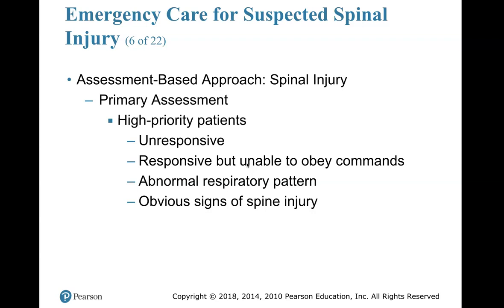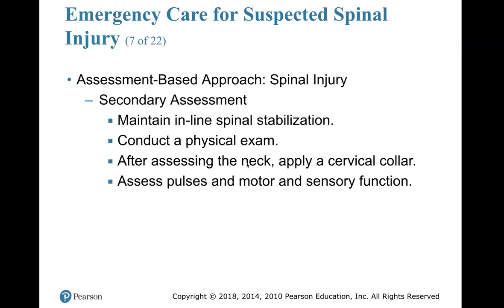Your high priority patients are the ones who are unresponsive or unable to obey commands, have an abnormal respiratory pattern, or have obvious signs of spine injury. During your secondary, maintain inline spinal stabilization and conduct a physical exam. After assessing the neck, apply a cervical collar. Assess pulses and motor and sensory function.